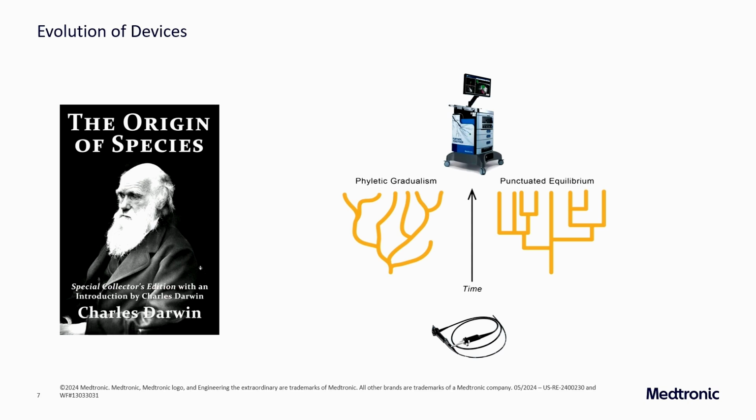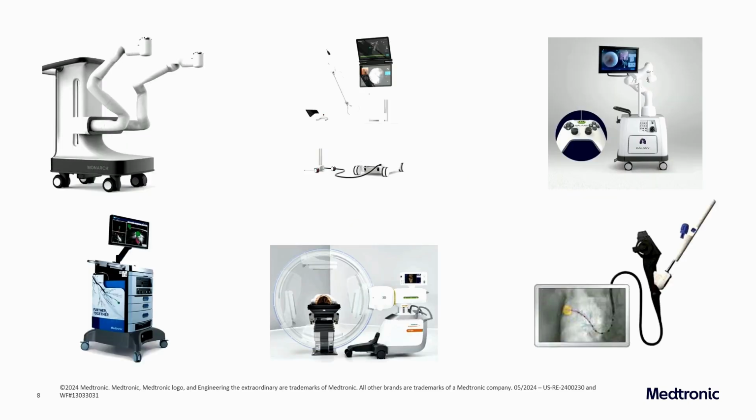And so we went from the handheld bronchoscope to a brand new device here, and now we have on the market a plethora of devices, and the question is, well, which one should we use? And the response to this is that, well, we don't really know because they were all approved on the same principle of substantial equivalence to predicate devices, and we don't have great data. So that clearance pathway of the FDA has really shifted the responsibility to produce useful data that can inform patient care from the companies to us.